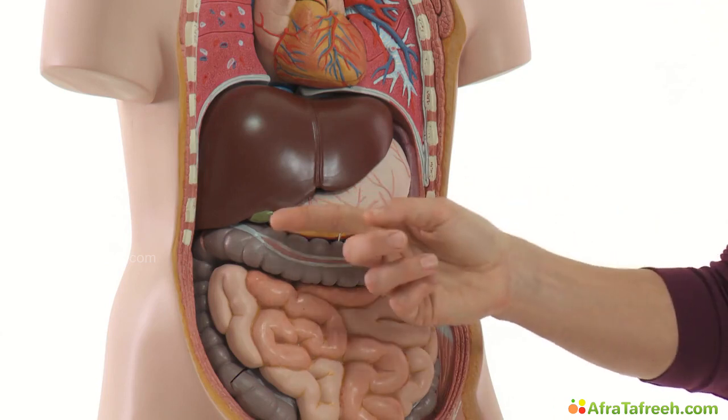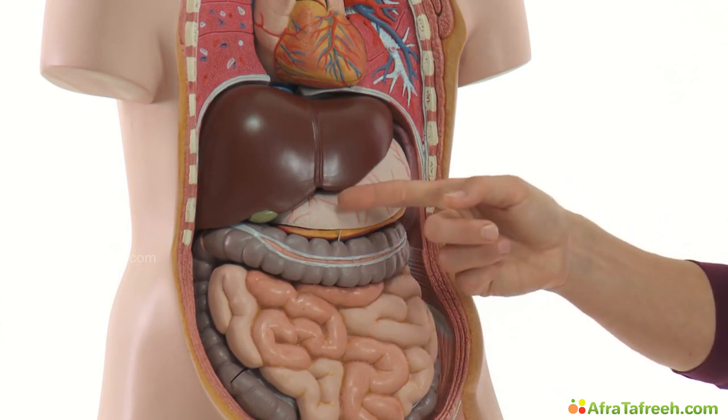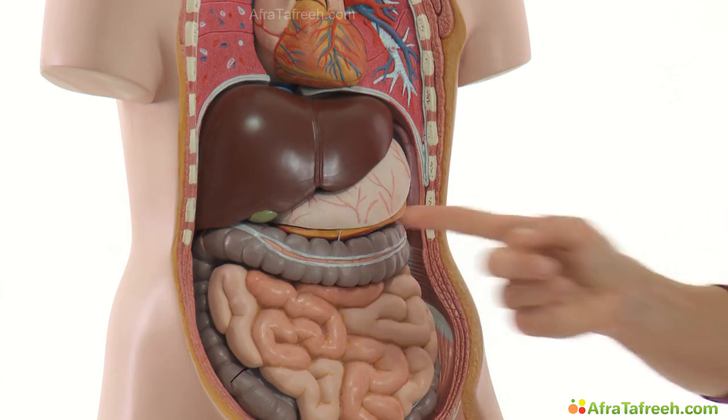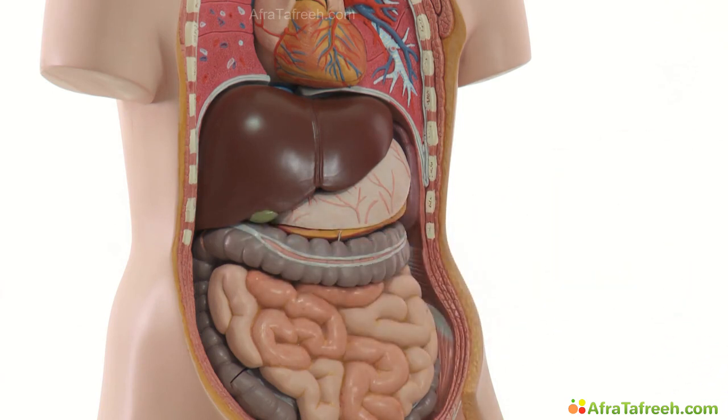For better orientation in our ultrasound examination, it's good to imagine the neighboring organs of the liver. We can see the gallbladder over here at the visceral surface of the liver. We can detect the stomach in the neighborhood and also the transverse colon, which is normally filled with gas, which can block the view of our ultrasound beam.